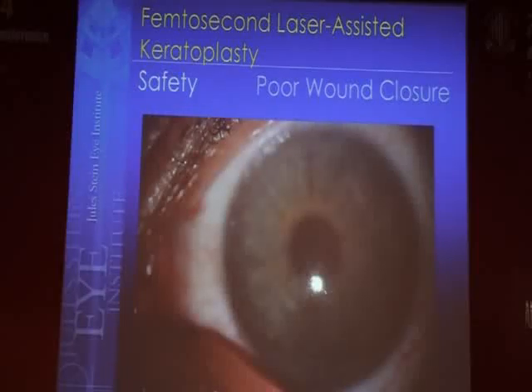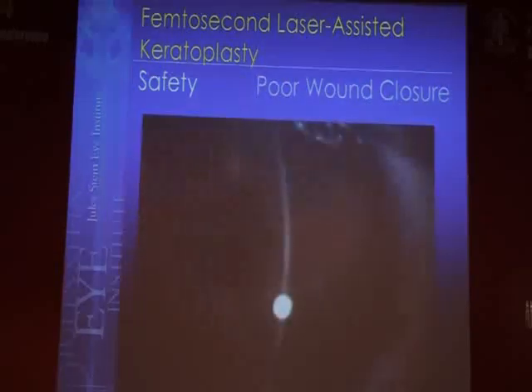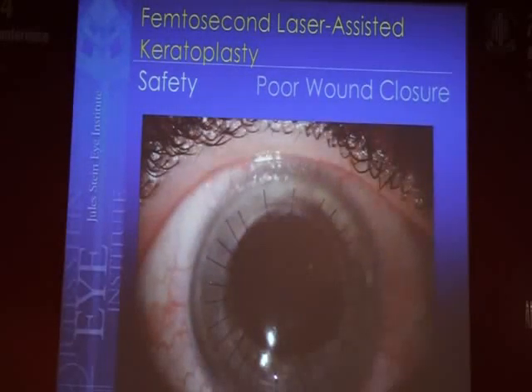I also avoid thin corneas. Here's a patient with macular dystrophy, which those of you from southern India see much more commonly than I do in Los Angeles. This patient's corneal pachymetry may be 460 microns. This is before I had set that 500 micron barrier.